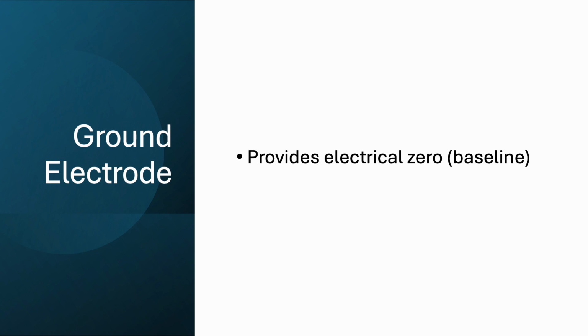And that's the first half. Remember, you're not here to become an electrician. However, your job deals with electrical signals, and the more you know about electrical signals, the better you will be at troubleshooting artifact and getting the best studies you can.